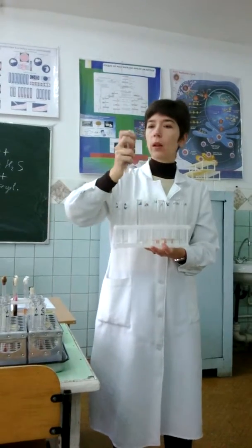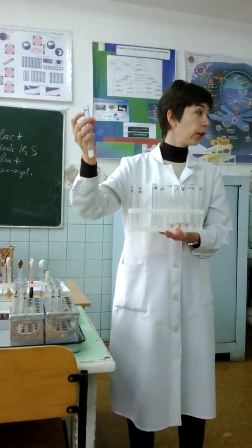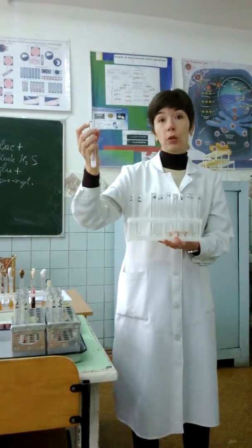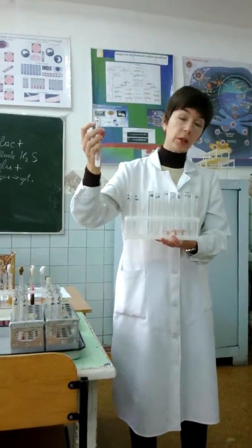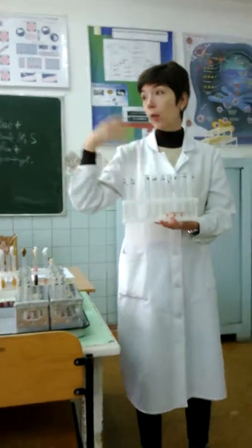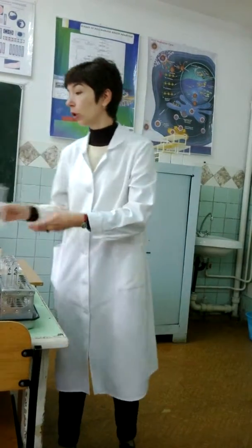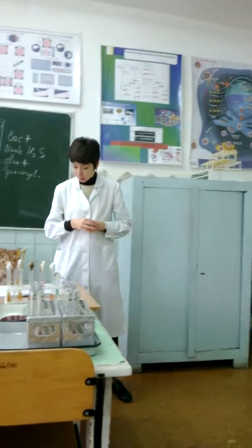Absent. The largest dilution, 800. The titer increased 4 times, from 200 to 800. Then it's diagnostically significant, a higher titer. It means we may confirm the diagnosis, it's typhoid fever. That was the test tube dilution agglutination test. And the last is the Wassermann reaction.